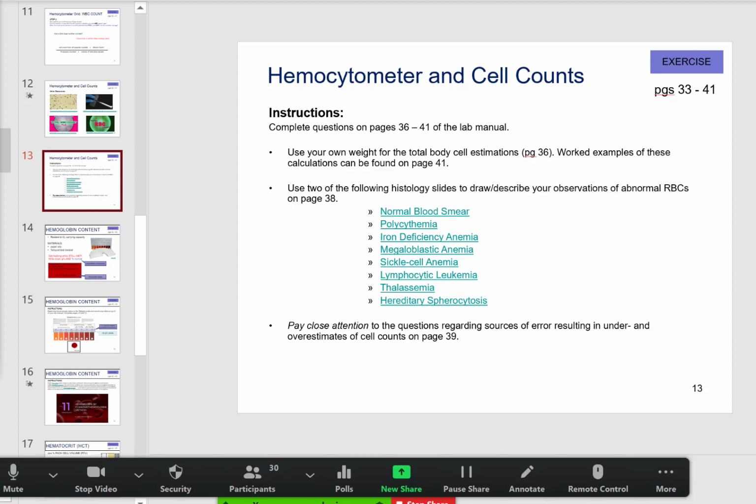I am not. The air bubble is taking up some of that volume, so I'm not diluting as much as I should. If I don't dilute as much as I should, then will I have a higher or a lower count? Lower? Higher? If I don't dilute enough, remember, a normal red blood cell count is 4.5 million per microliter. If I don't dilute your red blood cells enough, you're stuck in the lab counting longer, aren't you? So the count would be elevated, abnormally elevated.